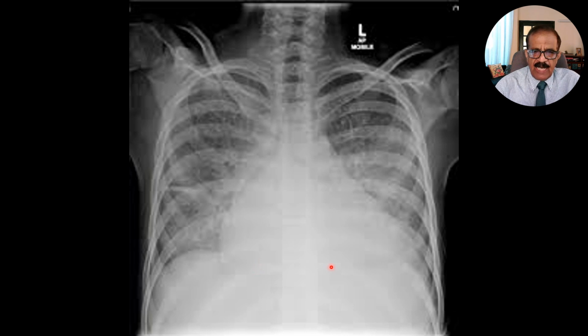This is another case of cardiomegaly, but there is actually another problem. One thing is that the cardiac border is not as sharp as in the earlier X-rays, because there are pulmonary shadows on both sides. This opacity is not as dense as the heart, but it is denser toward the hilum side, and as it diffuses out, it becomes faded. Similarly on the right side.